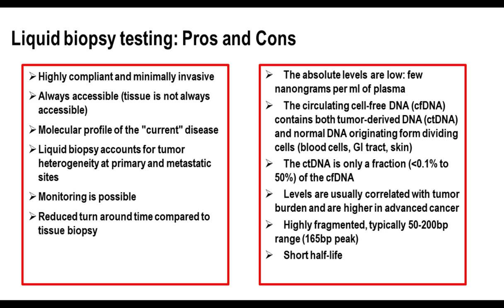I've said that many colleagues, in particular medical oncologists, are highly enthusiastic about liquid biopsy testing because this is a minimally invasive procedure with a high compliance from the subjects. It is always accessible, is very quick, and more importantly, you can repeat it several times so that you can monitor response to treatment as well as the molecular evolution of the disease. And this enthusiasm sometimes leads to underestimating the challenge of liquid biopsy testing.